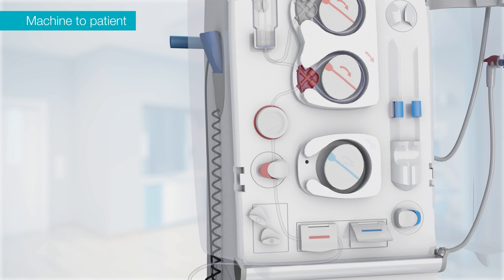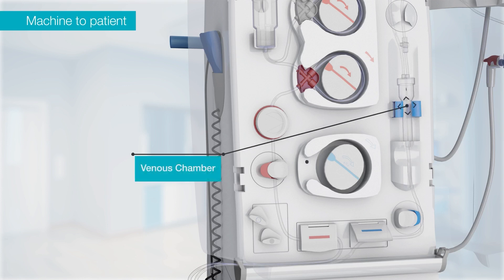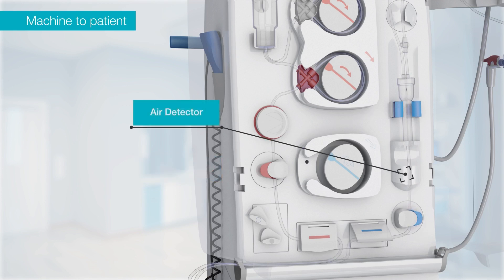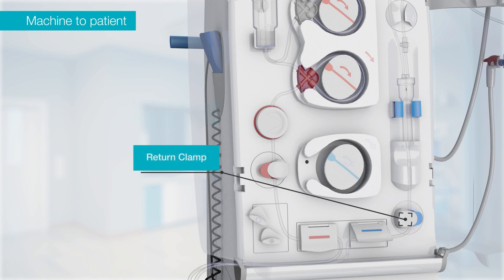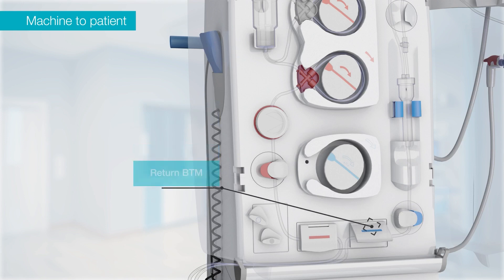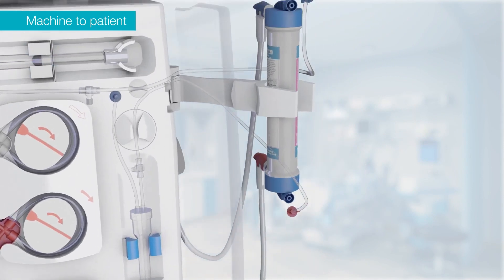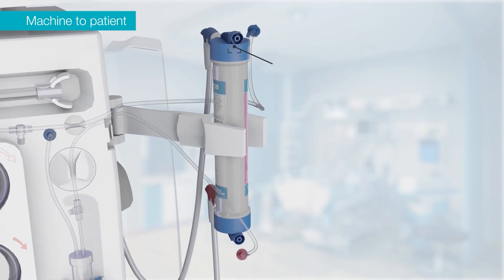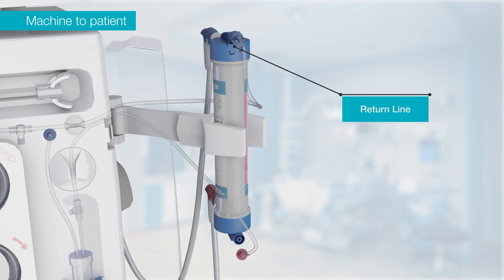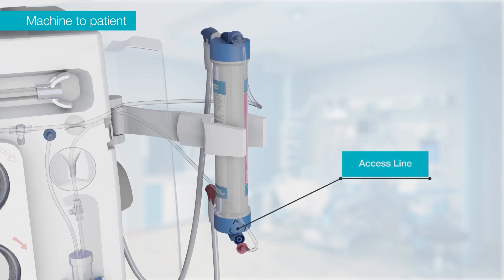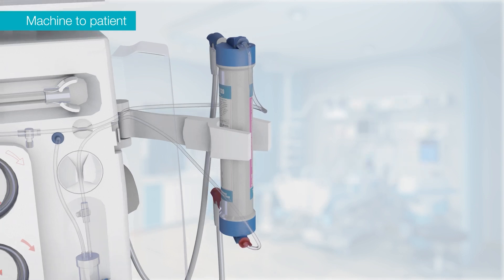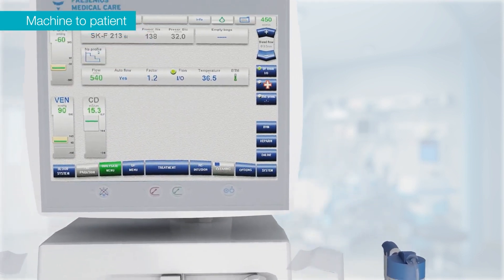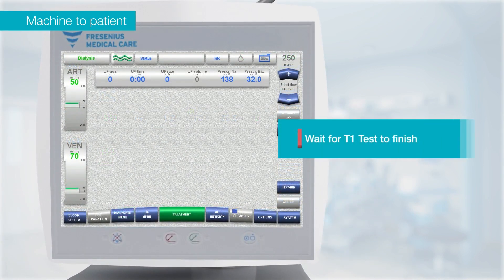For the connections from the machine to the patient, place the venous chamber on the right-hand side of the machine. Feed the line into the air detector, then into the return clamp, followed by the venous blood temperature monitor. Connect the venous pressure port and fix the filter. The return line is then fitted to the top of the filter, and the access line fitted to the bottom. Wait for the T1 test to finish.